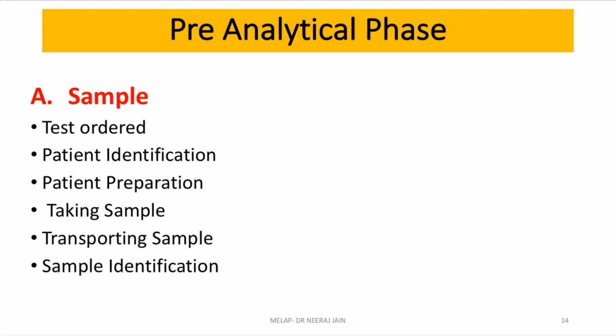They are pulling in samples. This transportation is very important. It shall be transported within a reasonable time frame at appropriate temperature, keeping in mind the safety of the sample, the safety of the person who is carrying those samples, as well as the integrity of the sample. If a sample is transported through a pneumatic chute, what precautions are required?